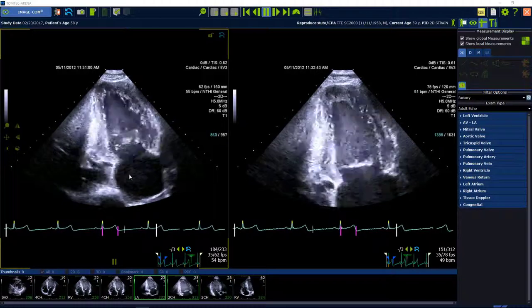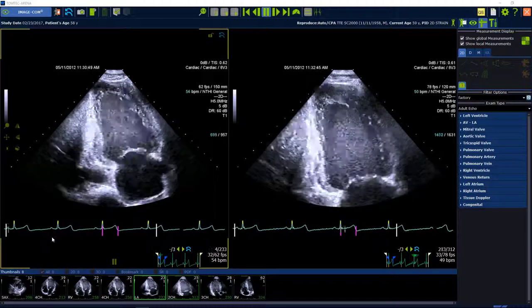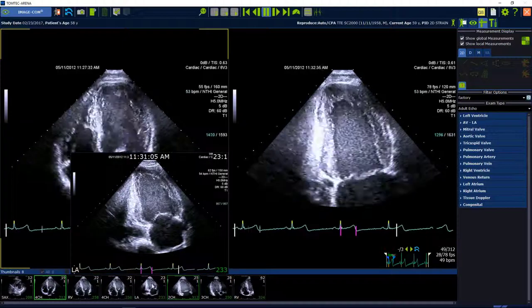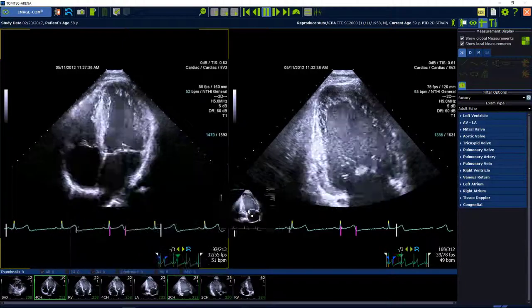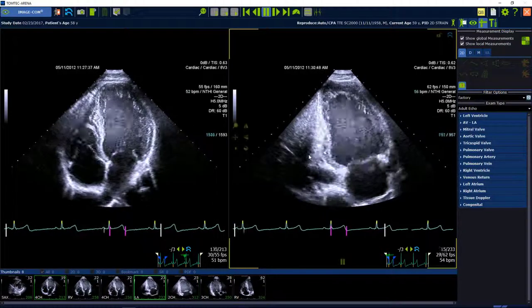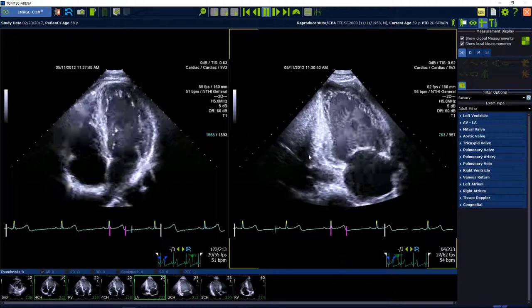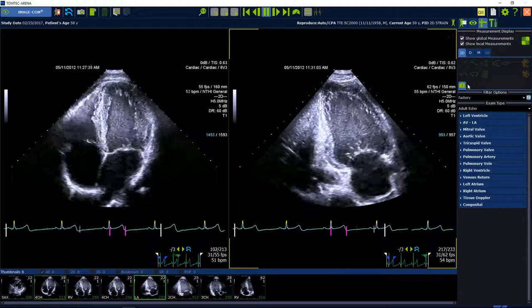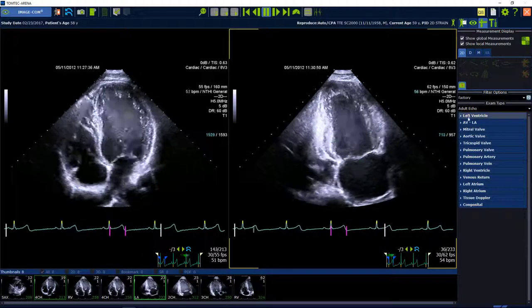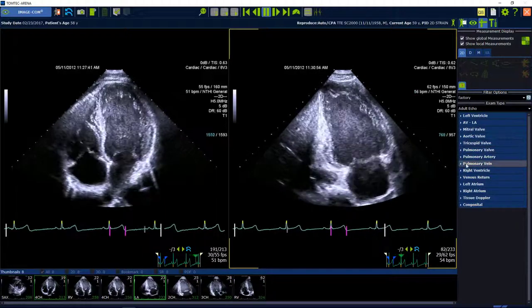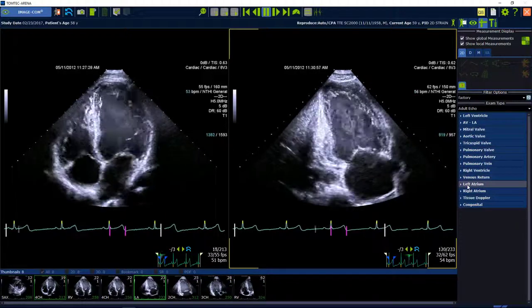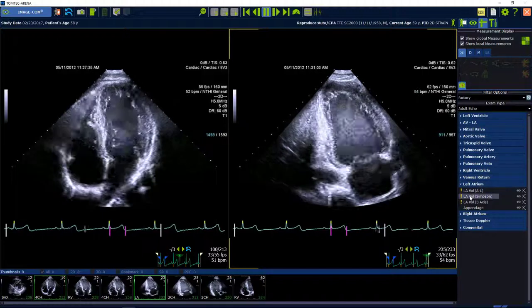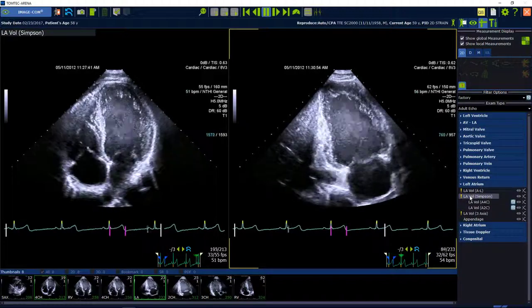To start the analysis, we drag and drop an apical four-chamber view and a two-chamber view in the workspace. Then select the measurement package, and here the left atrium, and under the left atrium we find left atrium volume Simpson analysis.